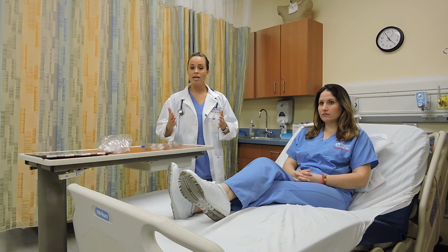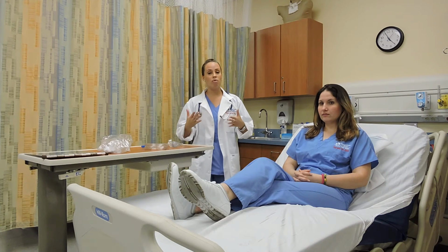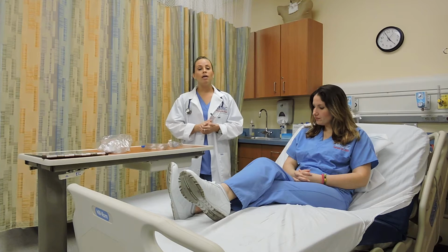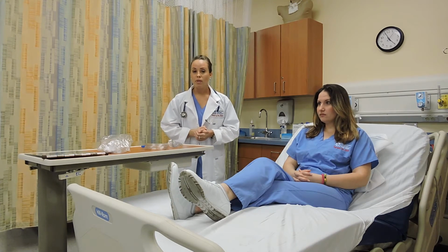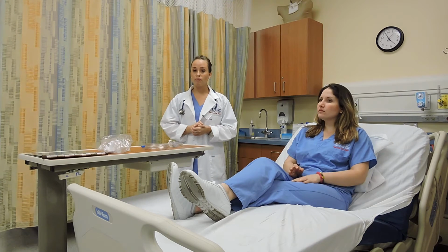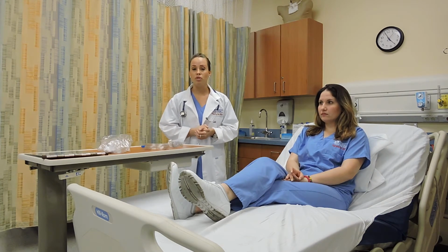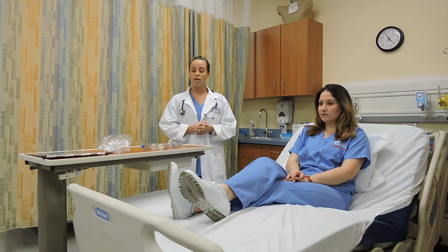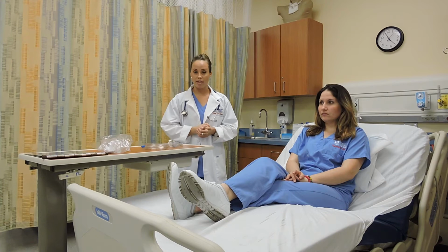On the other hand, EzPap is contraindicated in patients unable to tolerate the increased work of breathing, intracranial pressure greater than 20 millimeters of mercury, hemodynamic instability, recent facial, oral, or skull surgery, esophageal surgery, untreated pneumothorax, epistaxis, and acute sinusitis.